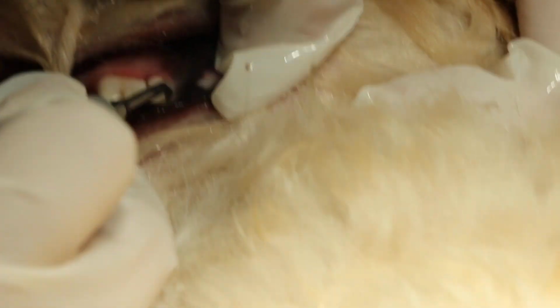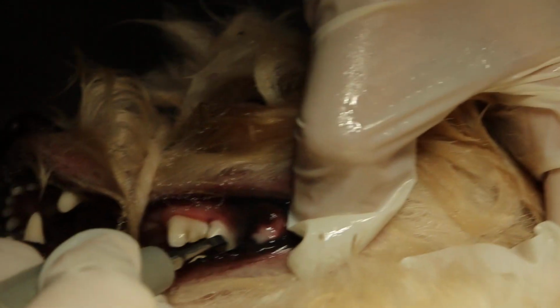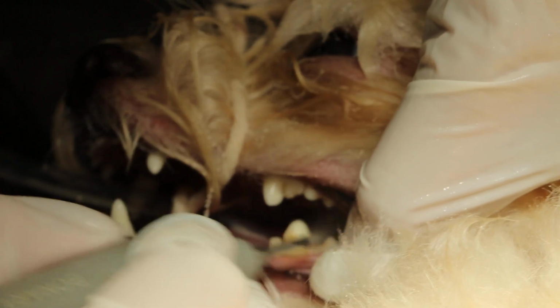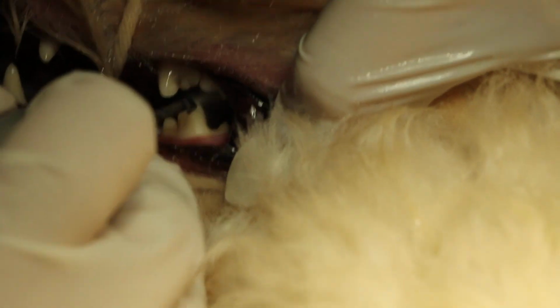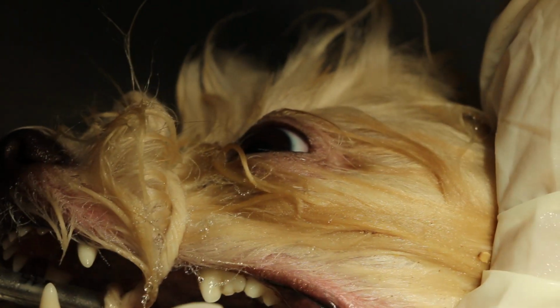Now you can see the gums are inflamed, so the owner will have to brush the back teeth more, at least 3 times a week. Now check, is the dog blinking? Check and see. No, right? Not blinking. Check the iris, is it dilated? No? Not dilated, right?